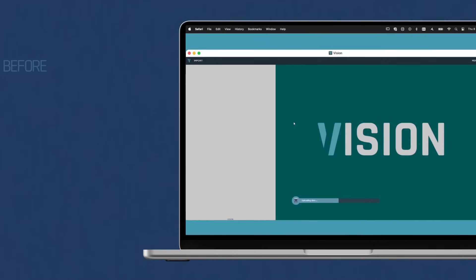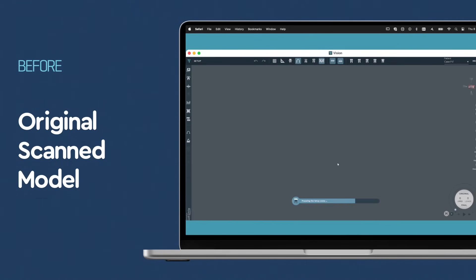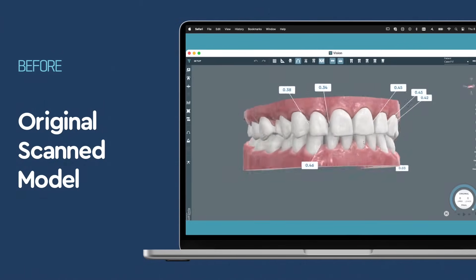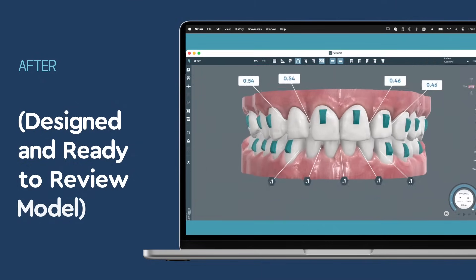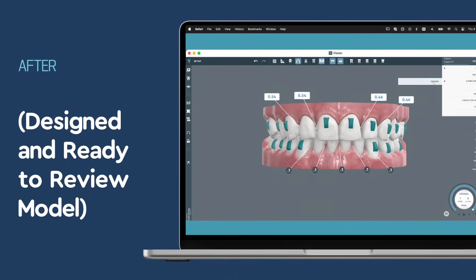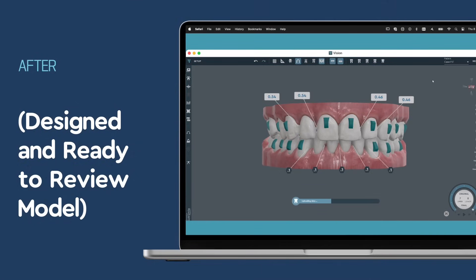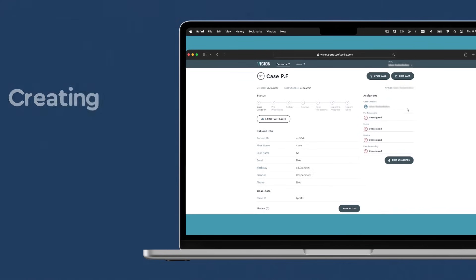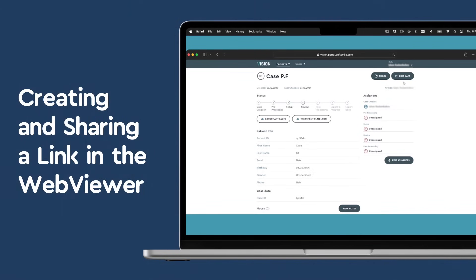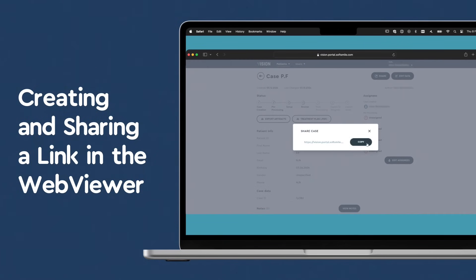After pre-processing, we move to the setup stage, utilizing advanced technology and expertise to create a precise, customized treatment setup for your patient. Our aim is to deliver a detailed and efficient setup, acting as the blueprint for the aligners.